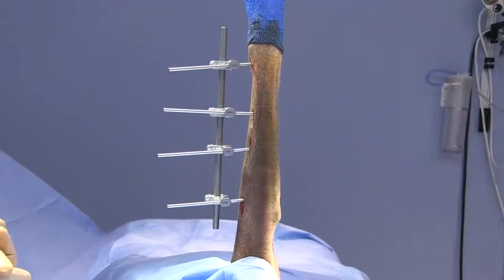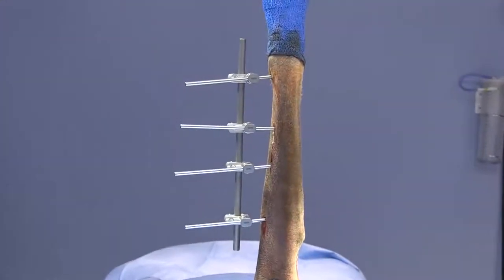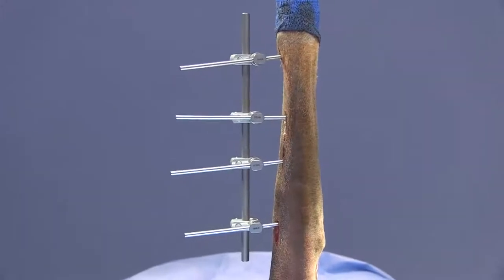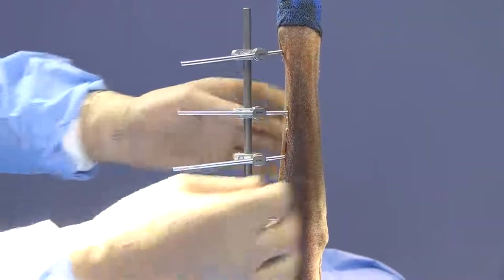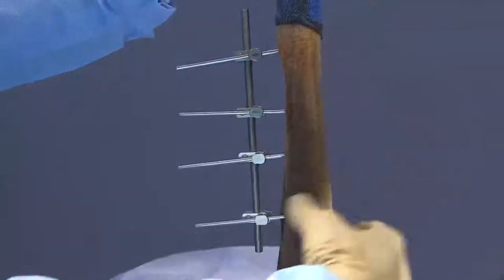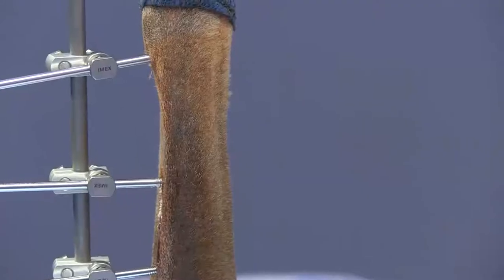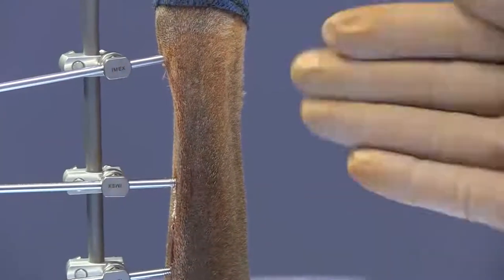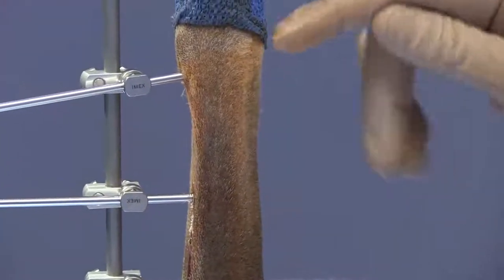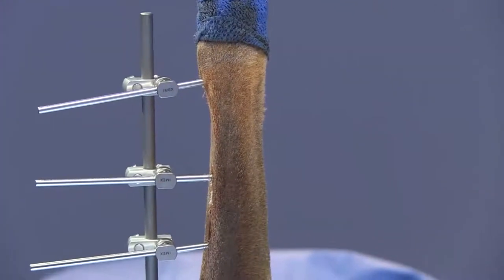If proceeding on with the additional construct on the opposite side, or if you decide you're happy with your linear fixator as is — we'll go ahead and start our placement here in the cranial lateral plane. That will make this a type 1b construct, which is going to be basically biplanar. We're going to plan our construct right here in this general plane on the cranial lateral aspect of the animal's antebrachium.